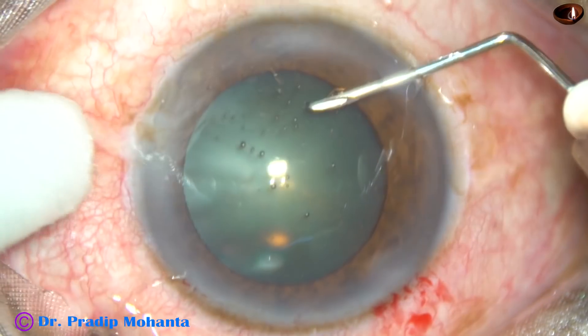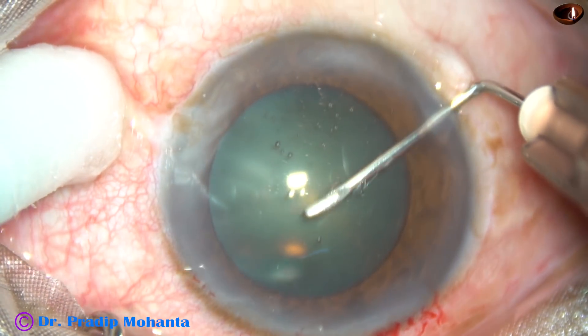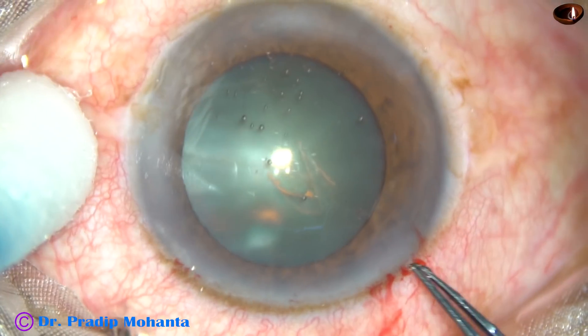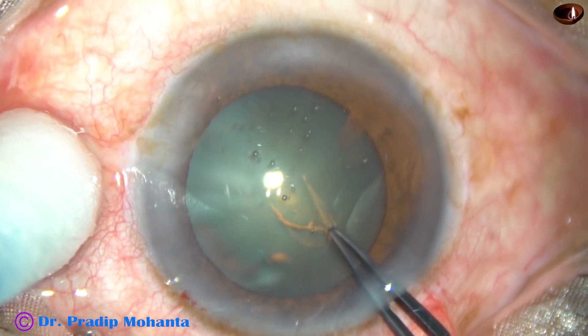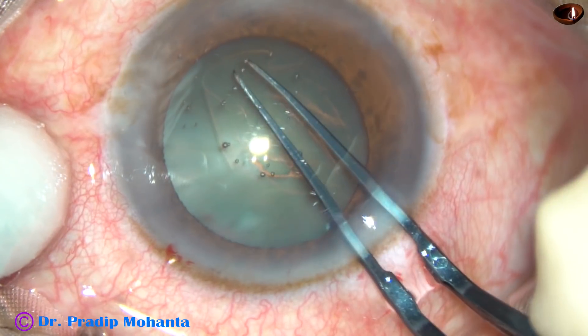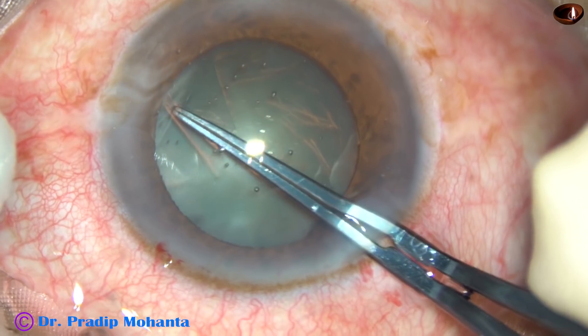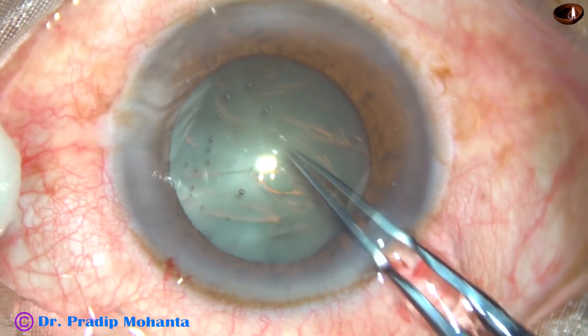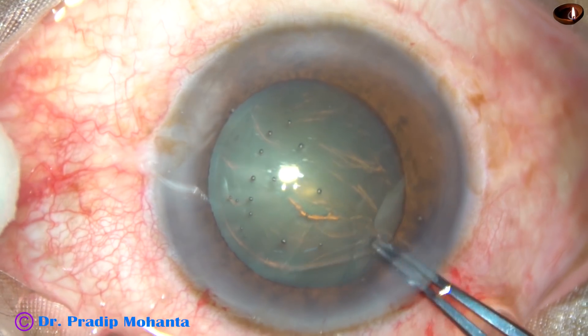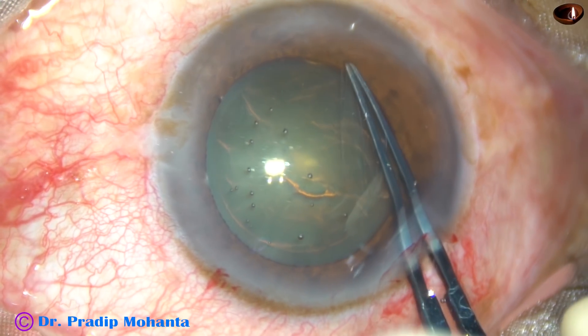Now, capsulorrhexis. The anterior capsule is incised. With a 26-gauge bent needle, a flap is raised. I use a Utrata forceps, hold this capsular tag with the Utrata, go anticlockwise, remain at a certain distance away from the margin of the pupil, and thus I do a fairly round rhexis.